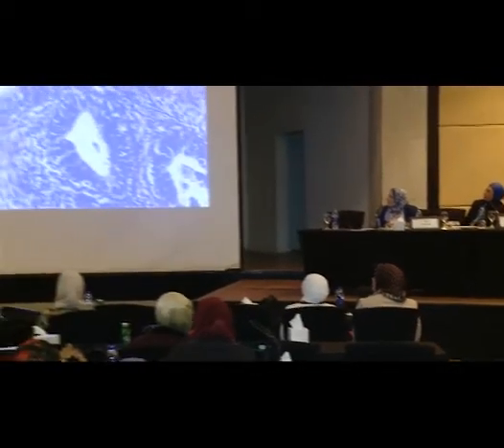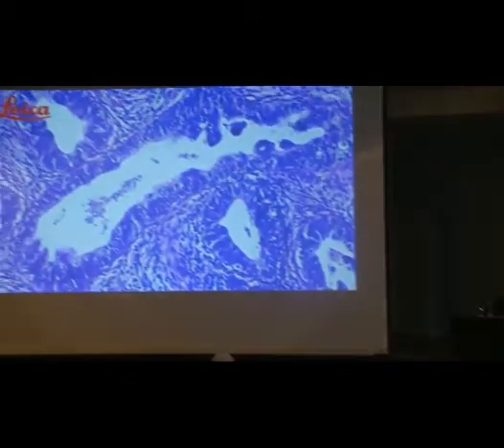Okay, so I told you in the morning that for the HPV-associated invasive endocervical adenocarcinomas, what you look at scanning magnification is for mitotic figures and apoptotic bodies in the apical part of the cells. Whenever you detect these, you are going to have a usual type, right? But you have to go very fast. If you have trouble identifying them, it may not be a usual type.